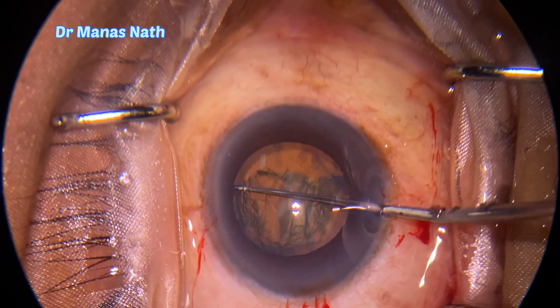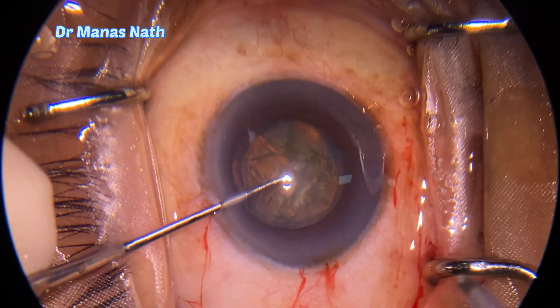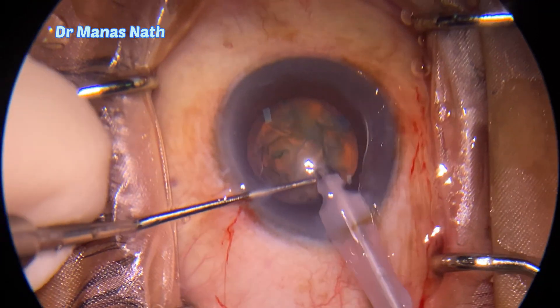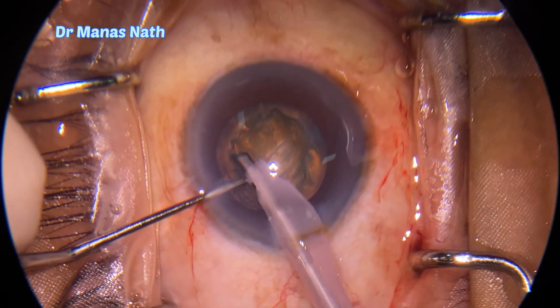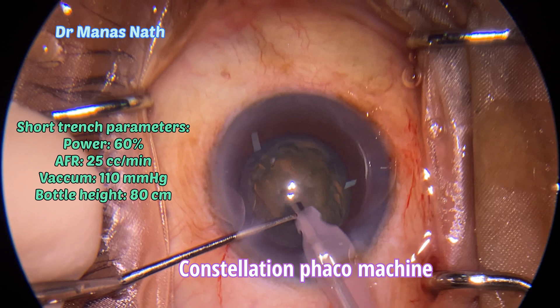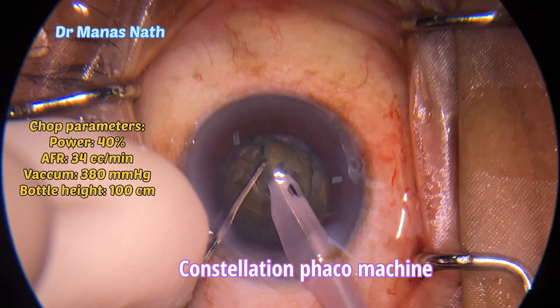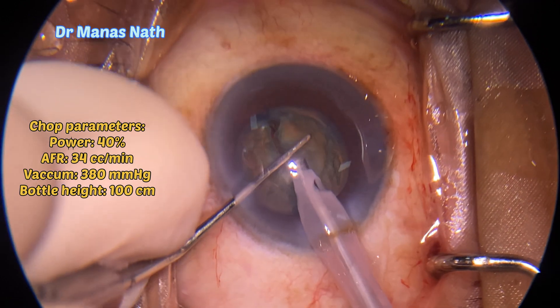You can see the fluid wave and now checking for the rotation. Now started my phacoemulsification, doing a short trench. Using this Constellation phaco machine here, making a short trench. Now I'm doing the chop.